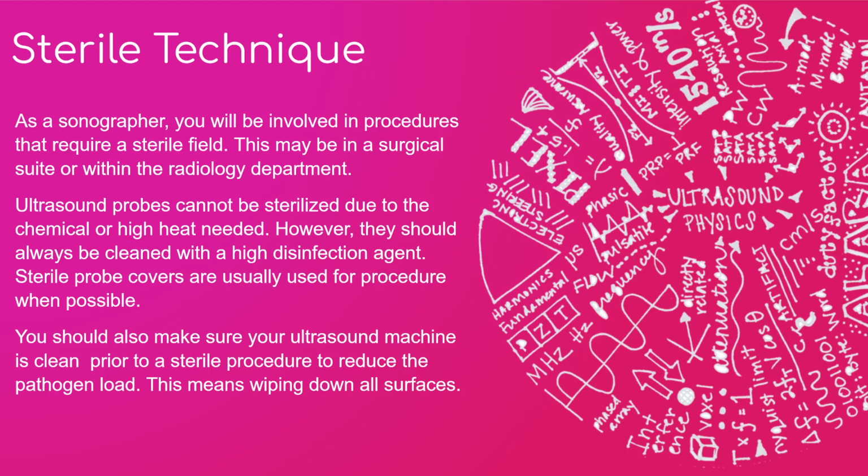The patient is sterile once they're clean, especially if they're doing abdominal work, or if they're cutting into the chest, or if they're cutting into the brain. All that area is going to be prepped and considered sterile. So you need to bring in a clean machine. You want to make sure you're wiping down your whole machine. You're going to bring in a clean probe. You want to make sure it's nice and clean. Use a probe cover to stay even more sterile. And they're going to help direct you on where they want you so you can help them with your imaging.